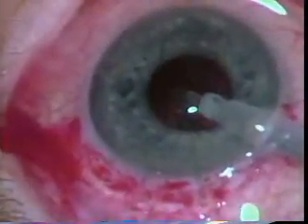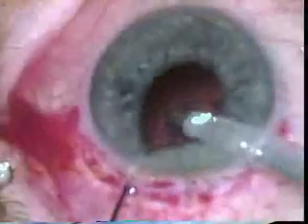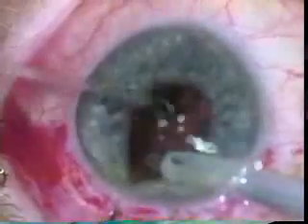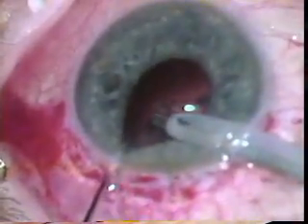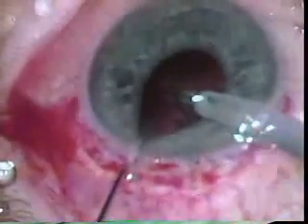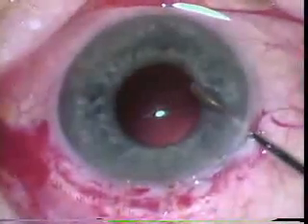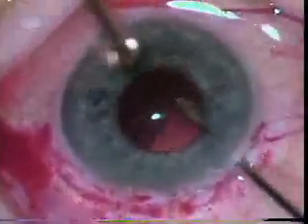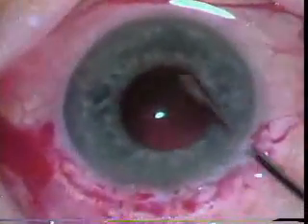It's tricky to do the cortical material with the extra cap because you don't have a nicely defined anterior capsular edge — you have a bunch of little tags left over when you do the can opener. Here you can see Dr. Colder using a two-handed technique, which is very difficult. He had such excellent hands. He's using the Kuglin hook to expose some sub-incisional material. This is an olive tip polisher — I sometimes call this the Johnson polisher after Dr. Tim Johnson who uses this.